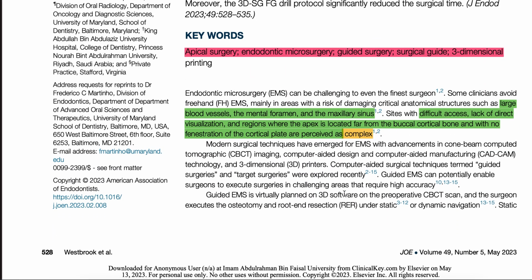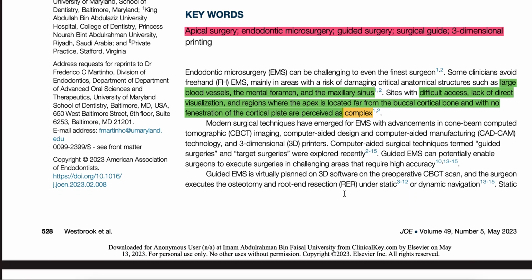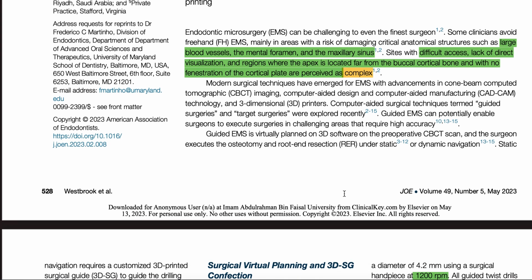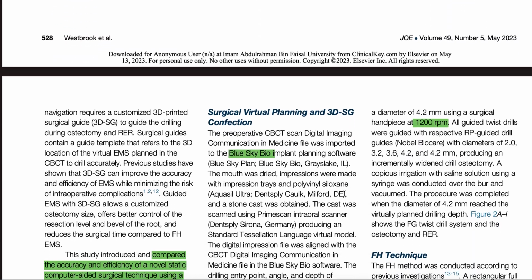To start, we all know the advantages of guided surgical endodontics, as it can avoid damaging critical structures such as large blood vessels, mental foramen, and maxillary sinuses, and of course improved access, especially in cases with lack of direct visualization and complex cases.